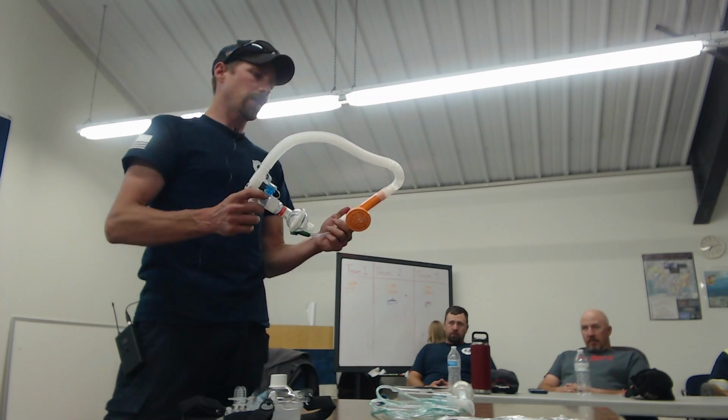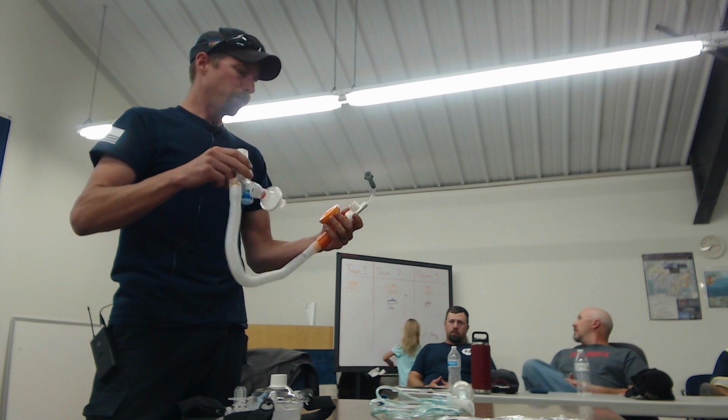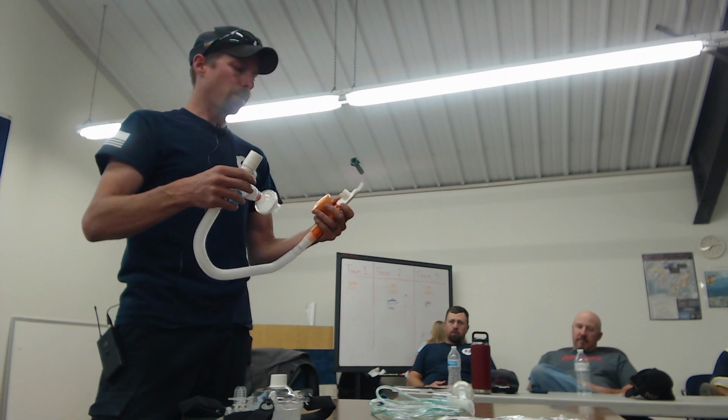Do be aware that this particular company has at least 30 different versions of this. Sometimes just because of stocking issues, it's hard for me to get the same ones every time, but they are all generally the same. Most of the time when I'm doing ordering, I'm looking for one that we can select the FiO2. It comes out of the bag set at 30.